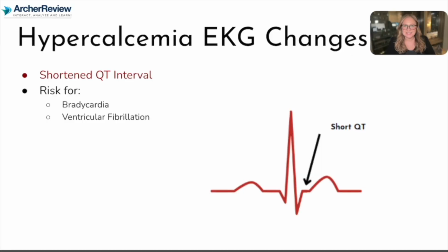All right, last but not least, what does calcium do to the EKG? It's primarily going to affect that QT interval. Once again, that's that Q from the QRS complex all the way to the T wave. With too much calcium, that hypercalcemia, the QT interval gets shortened. And that puts the client at risk for bradycardia and going into ventricular fibrillation.